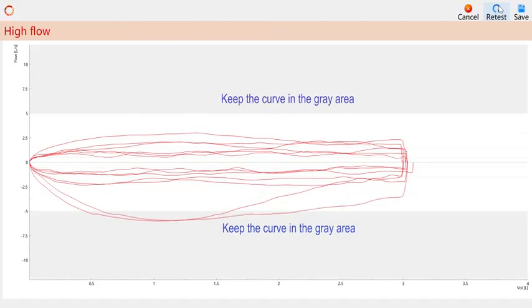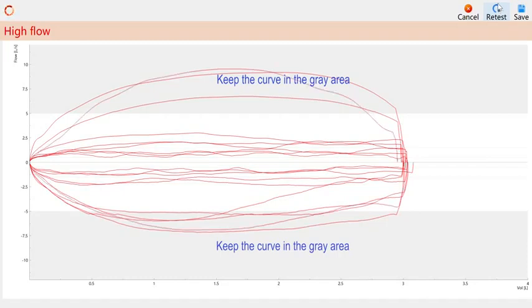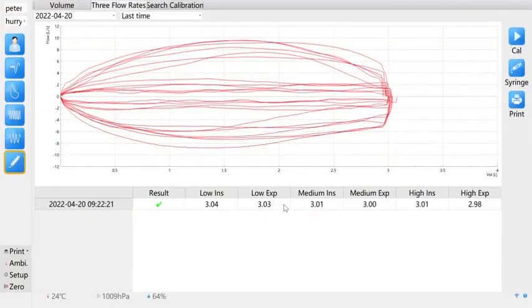Enter high flow calibration. High flow calibration should be in the gray area as well. The curve interval is more than plus or minus 5. Push and pull repeatedly for 3 times to complete the calibration. Click Save to enter the calibration result viewing interface.